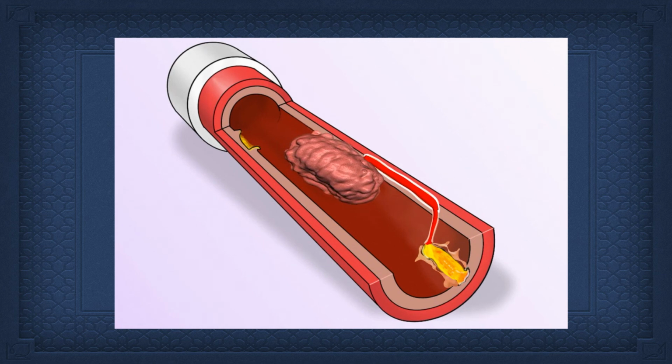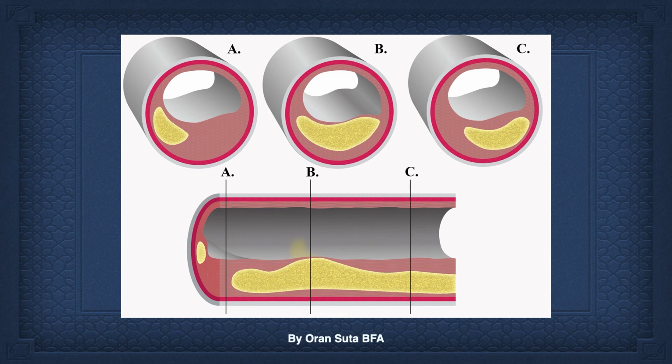Now, this can happen, and this time, in spite of the anticoagulants and antiplatelets, it occluded the vessel, so it was just a massive core evacuation. Now, this isn't the primary mechanism for ACS, and we go into that in other articles, but knowing you're dealing with a long necrotic core is likely very important. And the TCFA that ruptured downstream during the procedure, nothing happened to, because it wasn't associated with a long necrotic core. And again, these things spiral. They come to the surface, they drive deep, and it's going to likely turn out that this is important information when you're placing a stent.